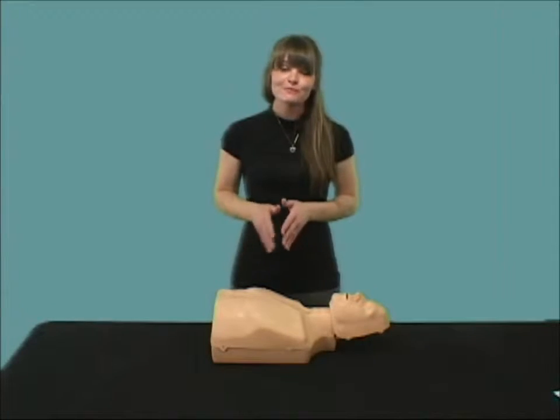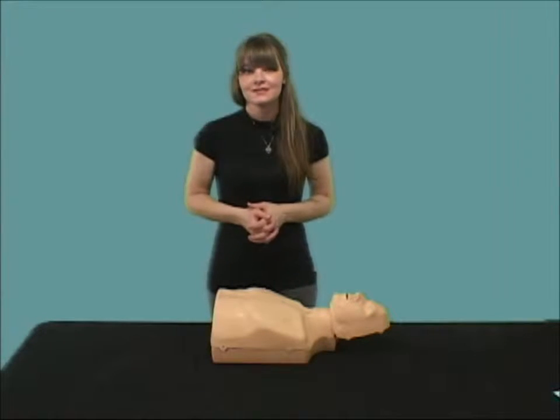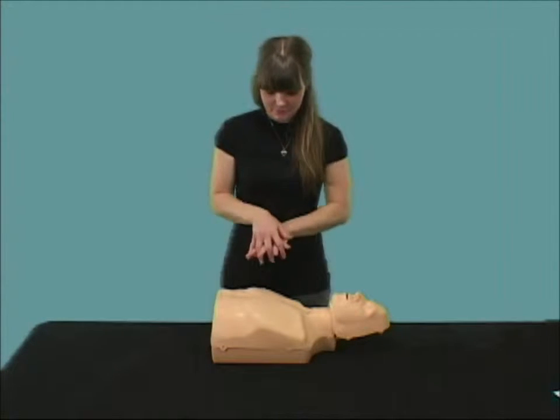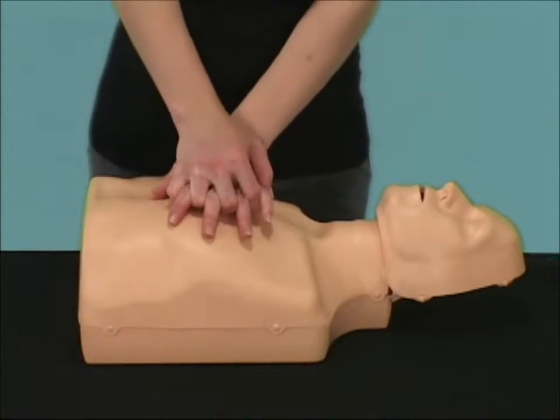The PractiMan is the only mannequin in its class that has two mannequins in one. Let me demonstrate how you would perform chest compressions. If you hear the clicking sound, that is confirmation to the student that the compressions are being performed properly.